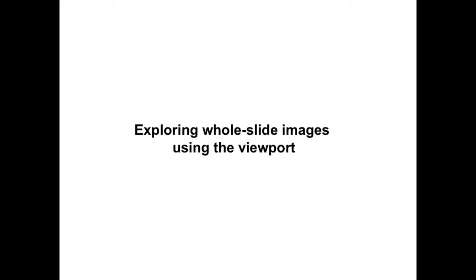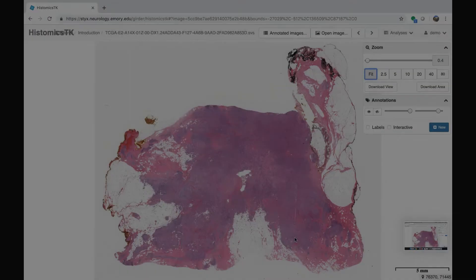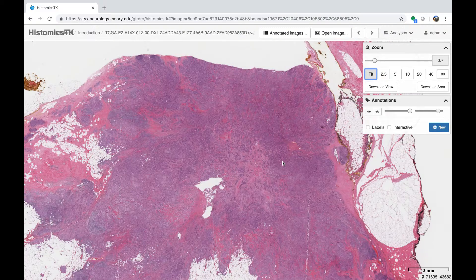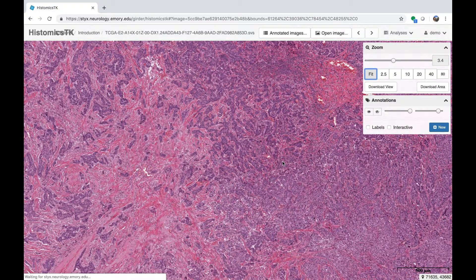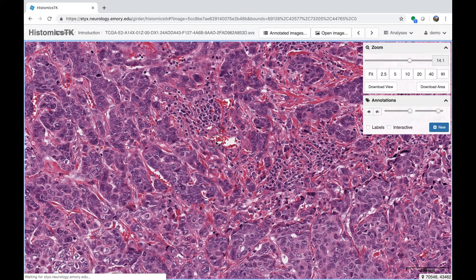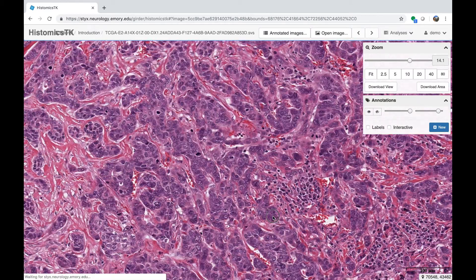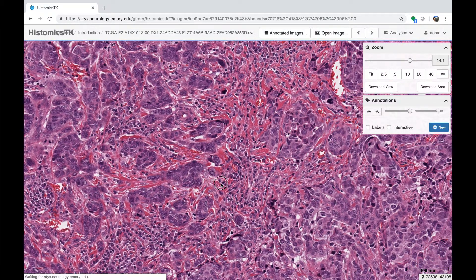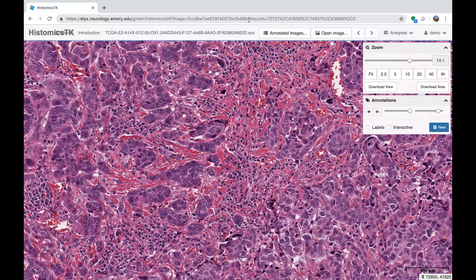Now you'll learn how to view images in the viewport — how to pan, zoom, and perform basic navigation through the slide. When a slide is loaded, you're presented with a low magnification overview. The viewport is everything below the HistomicsTK logo. You can move your cursor and use the mouse scroll to zoom into an area, and click and drag the image left, right, up, and down to pan. As you do this, the scale bar and coordinates update in the lower right corner, and the magnification updates in the upper right corner.